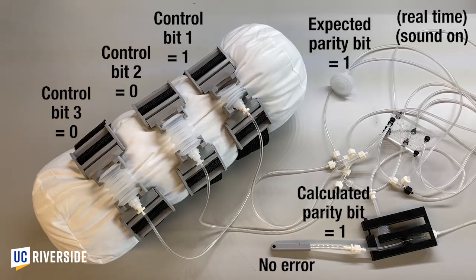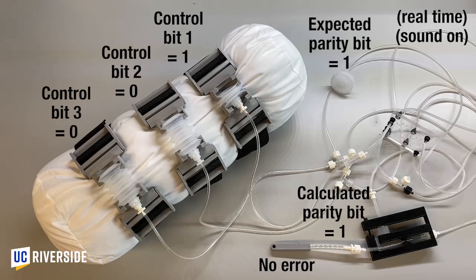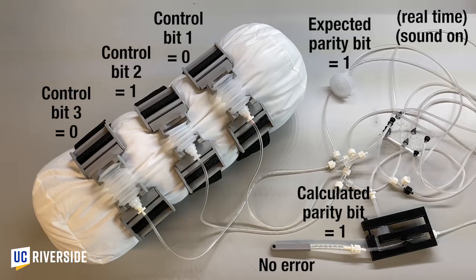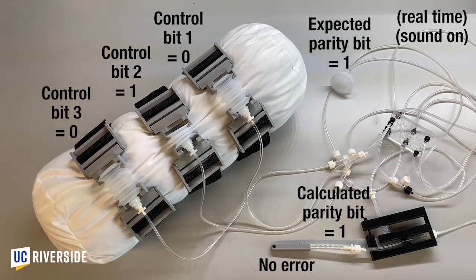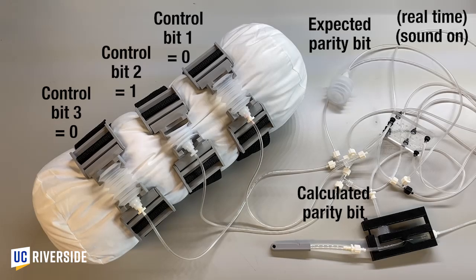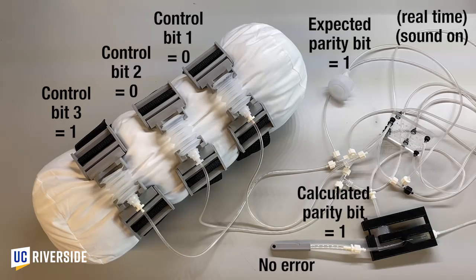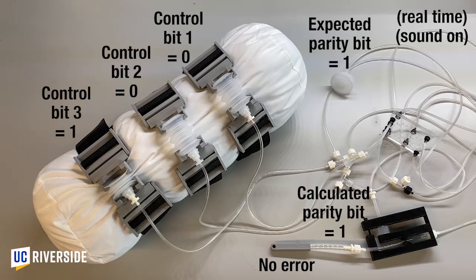Each time the control bits are changed as the device operates, the pneumatic error detector checks for any discrepancies between the expected and calculated parity bits. During normal operation of the IPC device, the expected parity bit and the calculated parity bit are the same, so the error output of the pneumatic error detector remains at atmospheric pressure, or 0, and no whistle is heard. We'll watch a few more moments of normal operation.